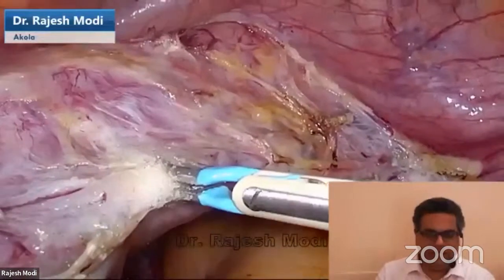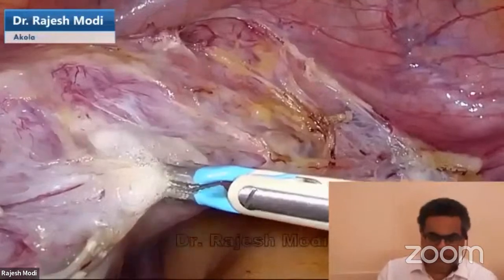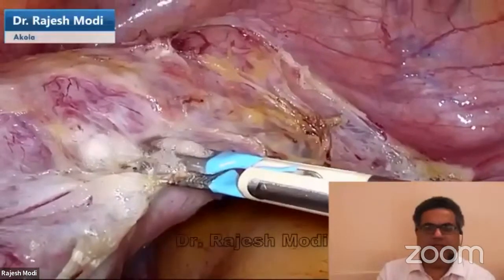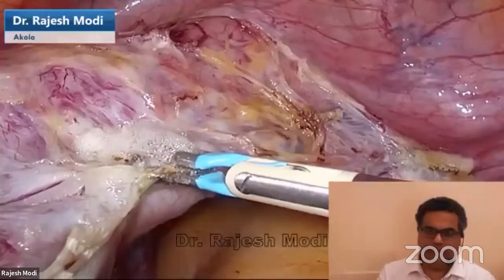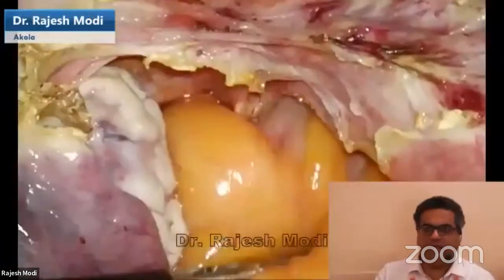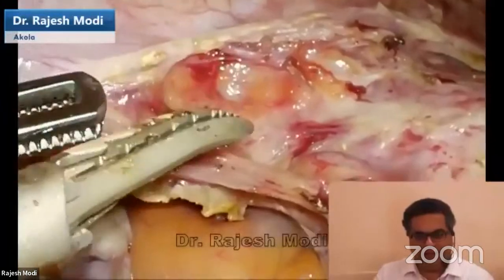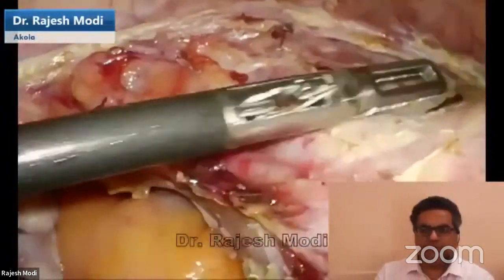Traction plays a key role in letting the ureter stay on the lateral pelvic wall while the uterine is being lifted medially away from the lateral pelvic wall. So when you coagulate and cut, there is no chance of the heat getting dissipated close enough to the ureter to damage it. Bladder, on the other hand, if the bladder is adherent, definitely there is a higher chance of damaging the bladder with ischemia. But ureter, you really have to make an effort to go lateral, cauterize close to the ureter, and then damage the ureter. So do not worry.